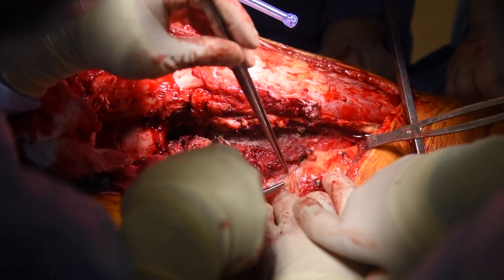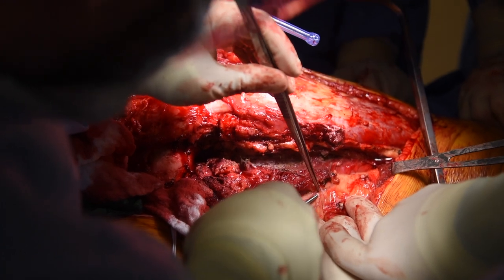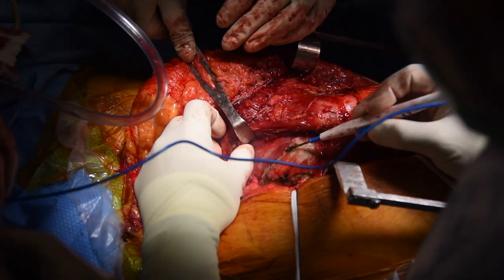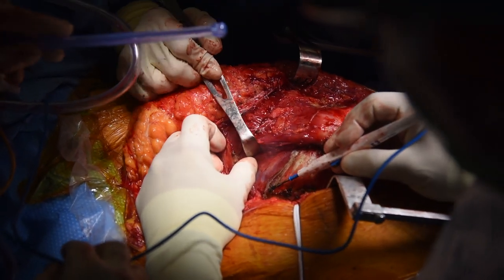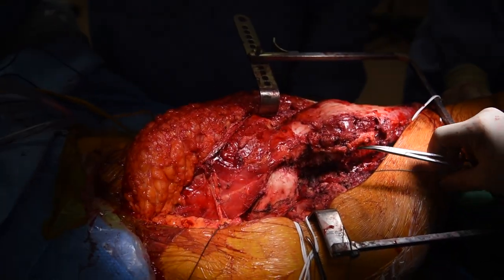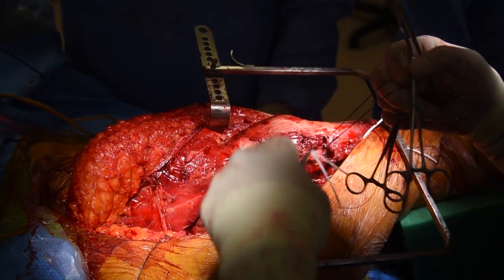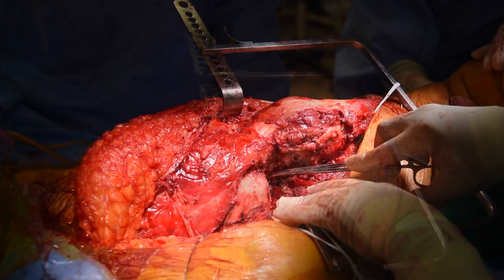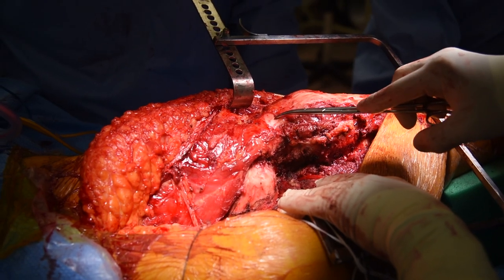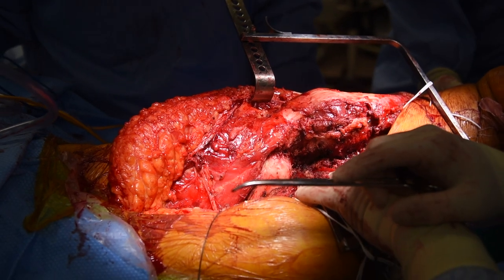Here is the gluteus maximus tendon and the gluteus medius insertion onto the greater trochanter. We will dissect the sciatic nerve and release the gluteus maximus tendon from insertion on the femur, protecting the sciatic nerve, then dissect to the joint capsule and identify the piriformis and short external rotators, tagging them separately and incising them cleanly from the capsule. Here we expose the hip. Here is the piriformis, the external rotators, and the quadratus femoris, which is important to save for later capsular reconstruction. This is the gluteus medius. There is no tumor extending above here intramedullary, so we will be able to save a piece of the greater trochanter with gluteus medius and gluteus minimus tendons and later repair it.